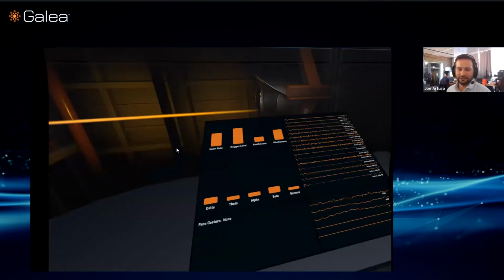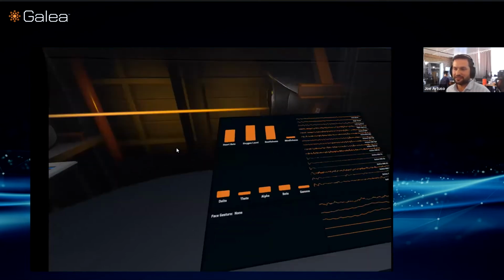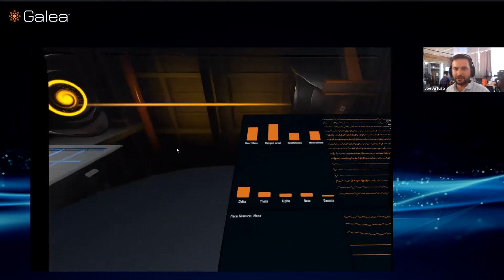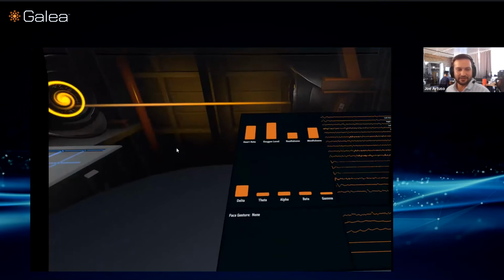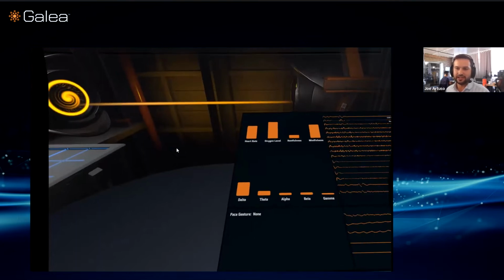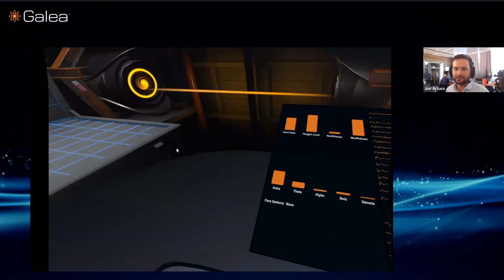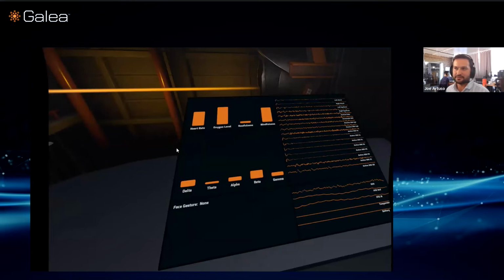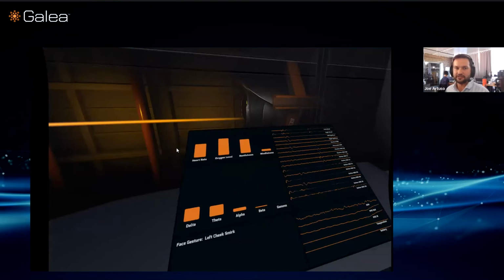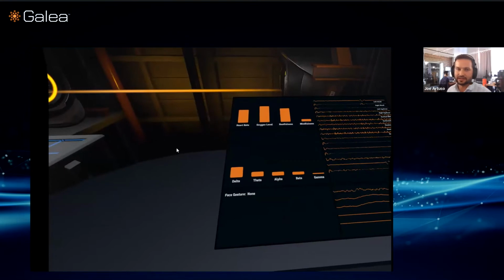It's something that we're selling to Galea customers right now. We've got a lot of customers from the gaming sector, and we're excited to see how they're going to be using it for their own play testing research, and whether there are gameplay elements that they bake in and start exploring. Maybe in future devices, it makes sense to have a small subset of these sensors so that we can roll this out at the consumer level. But Galea today is much more targeted as a developer platform, an R&D device for people operating at the intersection of head-mounted displays and neurotechnology.